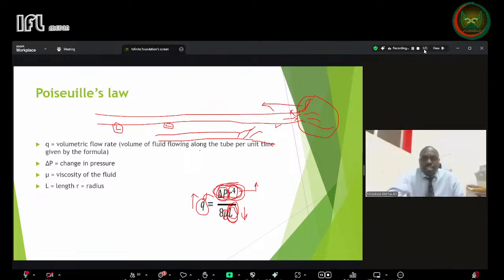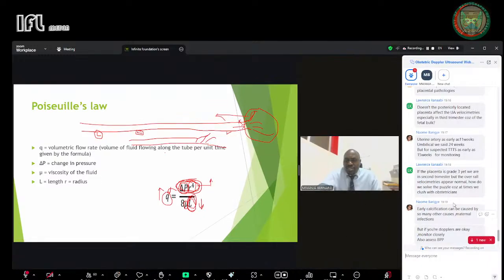Thank you. I'll take this last question from our friend Lawrence Kanabi. If the placenta is grade 3, yet we are in second trimester, but the overall velocimetries appear normal, how do we solve the puzzle? Because at times we clash with the obstetricians. My opinion is that ours is to report what we've seen and then hand it over to the obstetricians. But Amos, I want you to give your opinion on this.